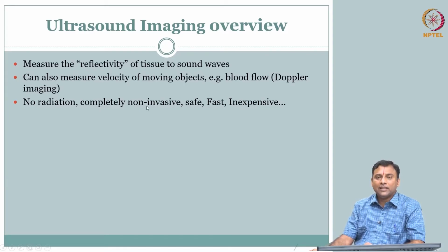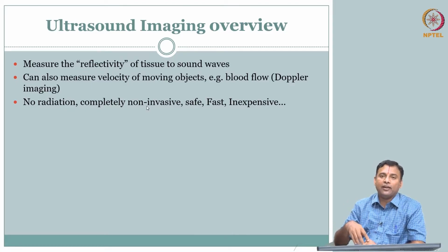Of course, in some cases, remember we talked about sending a camera, minimally invasive, if you would call it that, through a natural orifice. Like that, here also you can send an ultrasound probe, but it is still considered non-invasive. It is safe, of course: no radiation, no ionization, so it is considered safe.